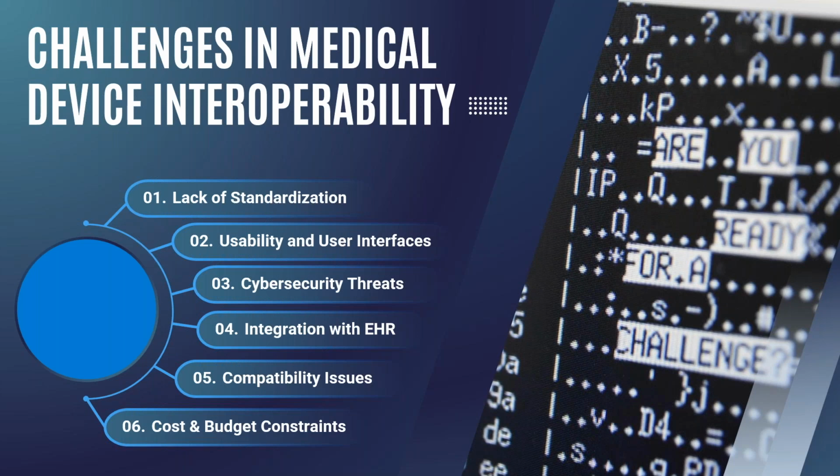And then integration with EHR, whether or not you're upgrading your EHR or changing over from an EHR that's 40, 70 years old. That is always an issue because you have to make sure that the device will currently work with the existing EHR, as well as sending information and then transforming that and making sure it works with the new EHRs.